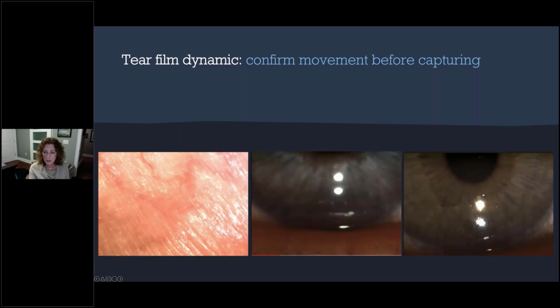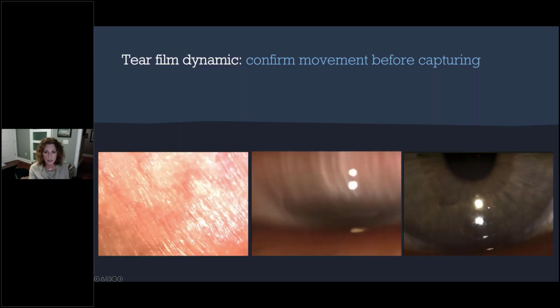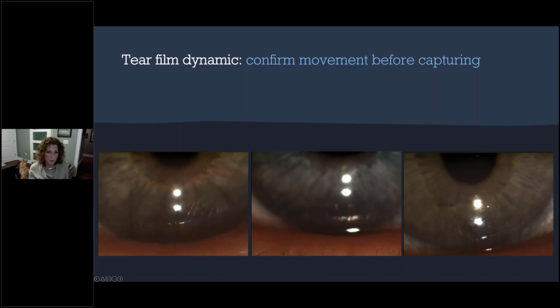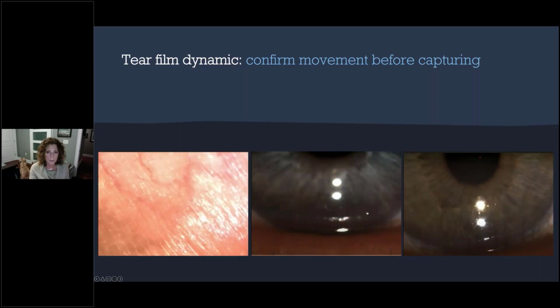And then other sources, allergic mucus and debris. Of course, if a patient has a really low tear meniscus height, tear volume, they're going to have a more hyperosmolar tear film, and so you're going to see a lot more floating around in the tear film.